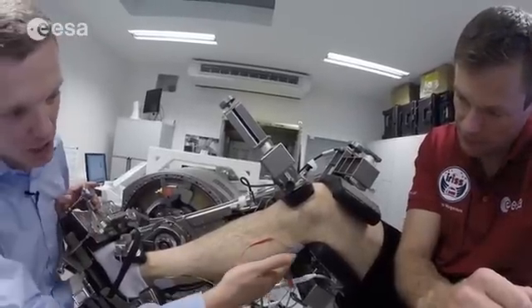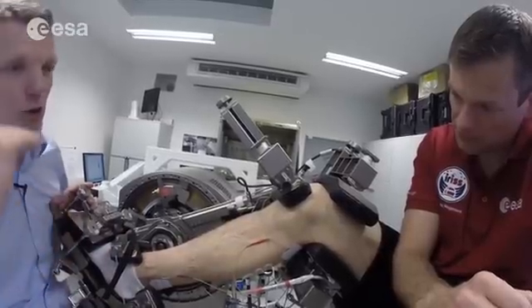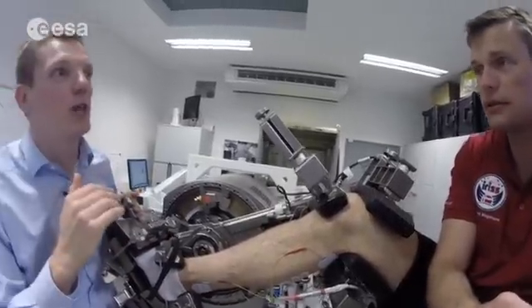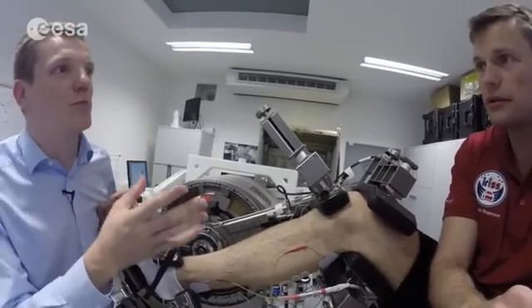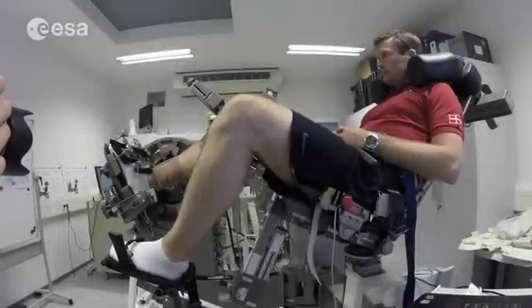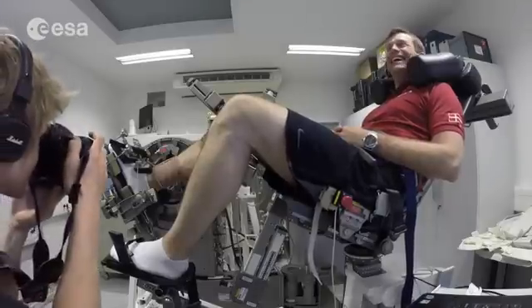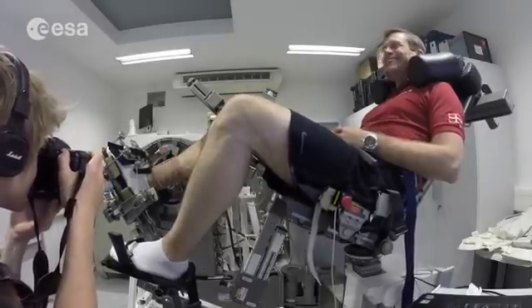And using stimulation electrodes here along your muscle, we can apply a known standard level of stimulation independently from your control or from your muscle, and we see the resulting force. To test your muscle performance. Yeah, okay, sorry. It's good to distract you. Yeah, I can see that.